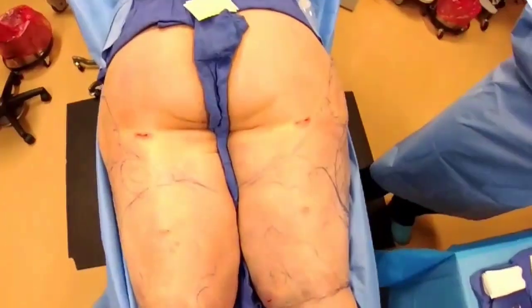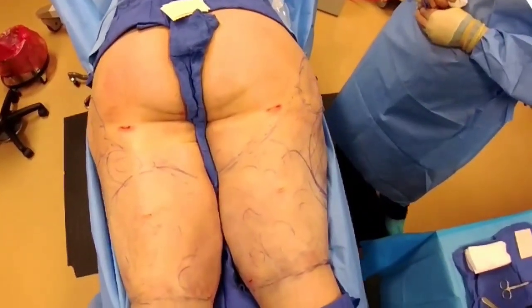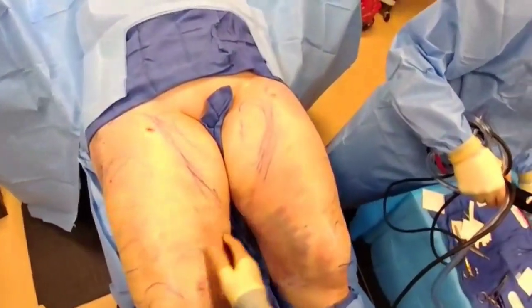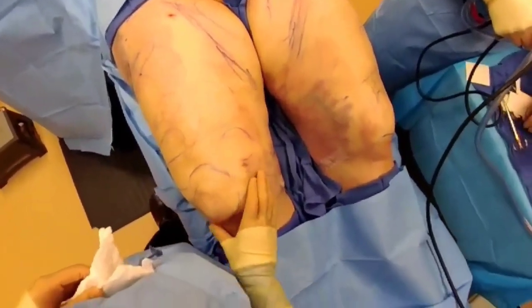The liposuction of the back of the thighs is done — a lot smaller. We're going to start by flipping the patient over into the front. Just about to start; there's some bruising from the liposuction from the back. We're going to liposuction all of this here, including the knees — mainly the knees.